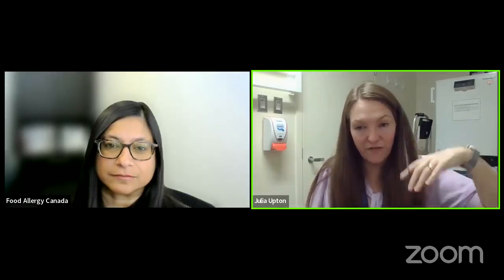That's a great explanation. Is one epinephrine auto-injector better than the other for treating a reaction, or are they equal in effectiveness? The best one for you is the one you like better, because it's the one that you're much more likely to carry and the one that you're more likely to use. It's exactly the same drug. It really comes down to, if one of these is more appealing to you, in terms of the carriage and in terms of the use, then that's the one that you want. Some people have both because they feel like maybe the babysitter could do with the talking of this one, but they have a great familiarity with this one. So that's a very personalized decision, and they have exactly the same drug.